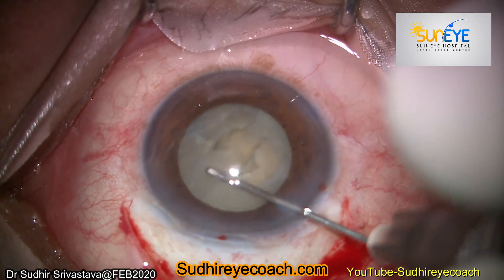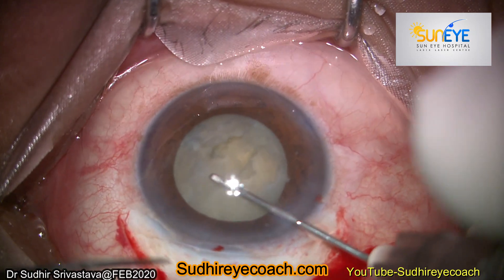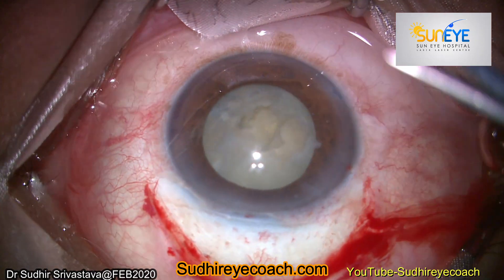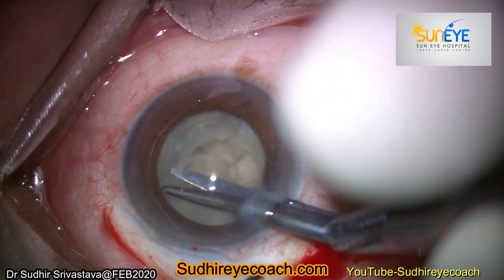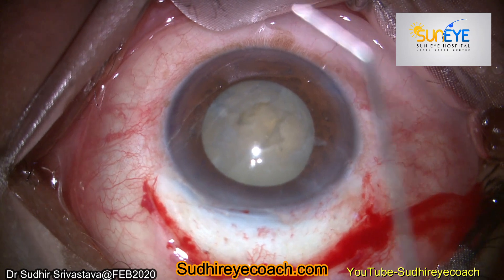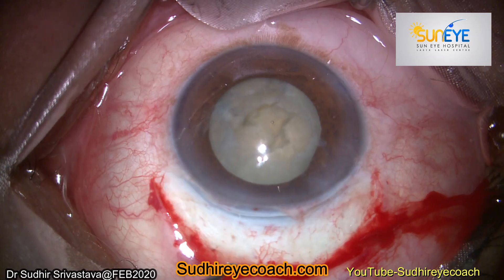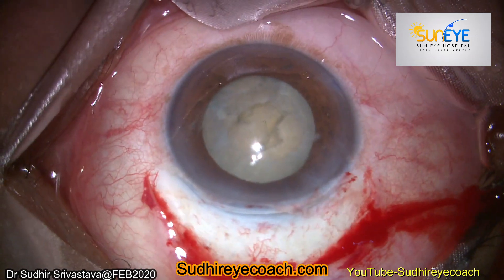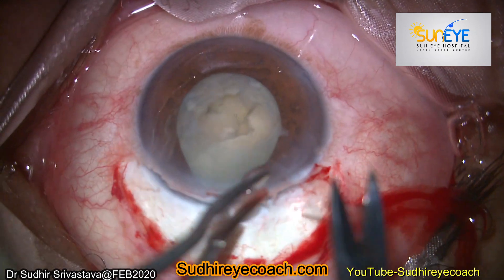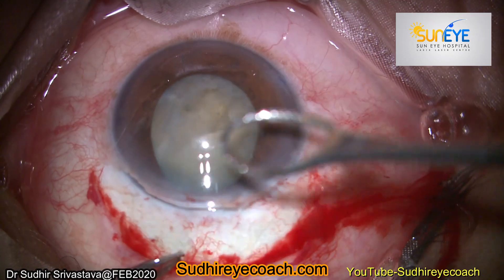After several thoughts I realized to handle this case in an orthodox manner, so I planned to convert the case to extracapsular cataract surgery and I compromised the axis. I prepared my corneoscleral incision. Before making the corneoscleral incision, always check the intraocular pressure — your eye should always be soft.